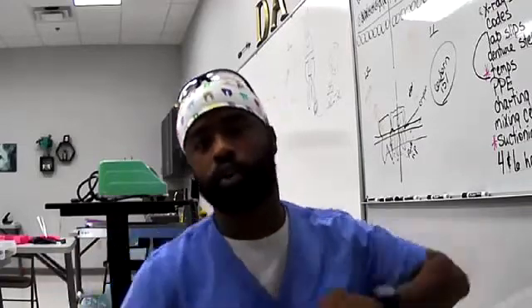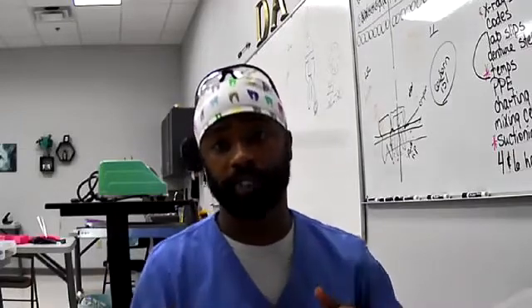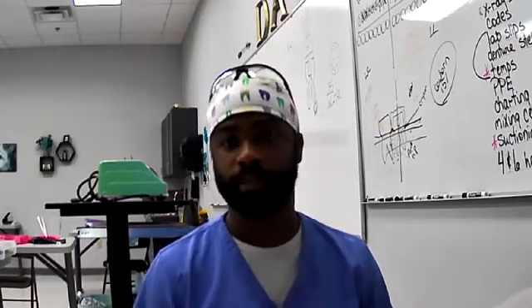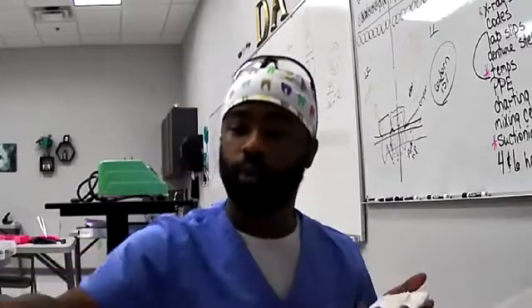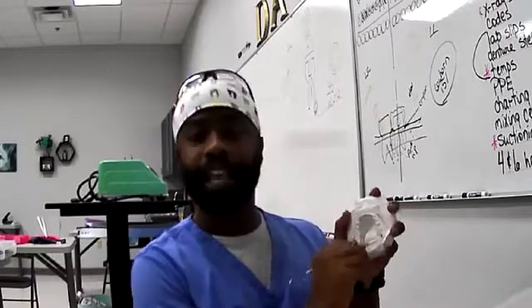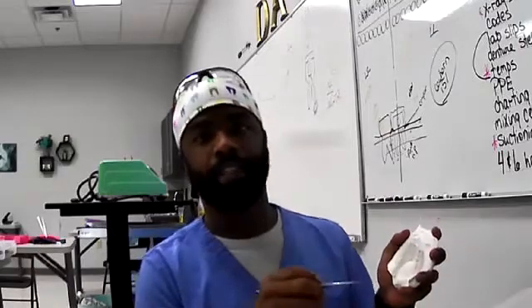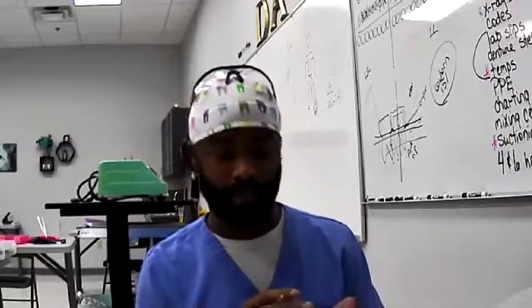All right. So, first step for any kind of filling, but we're gonna do an amalgam filling, which is the silver filling. The first step is removing the decay from the tooth, which is where the dentists use the high speed and slow speed handpieces and actually take out the bad part of the tooth. So basically taking the decay, or the sugar bug, out of the tooth, that'd be the first step.